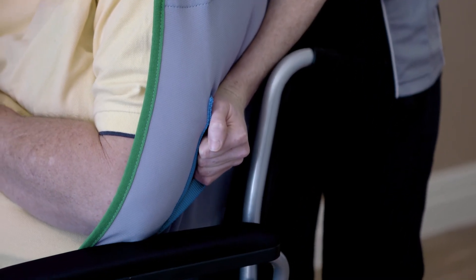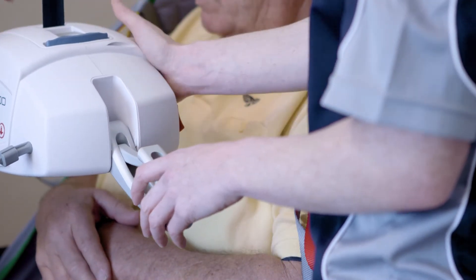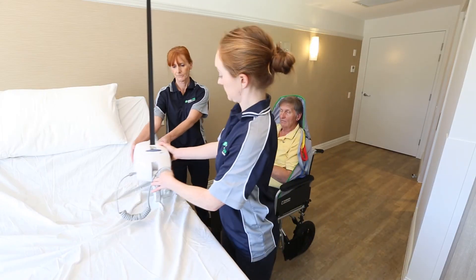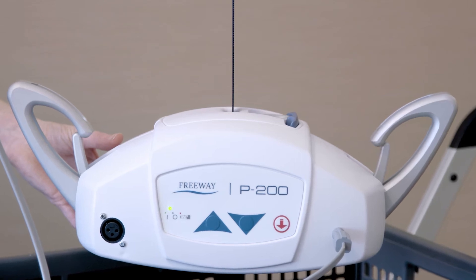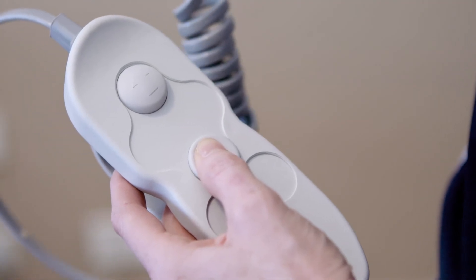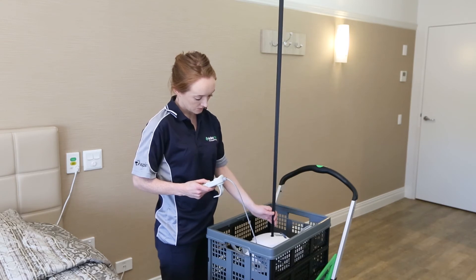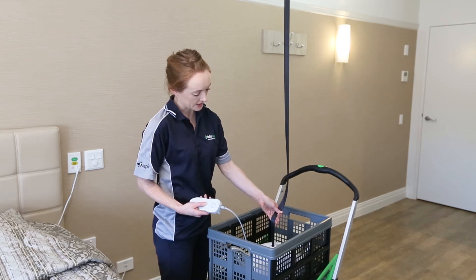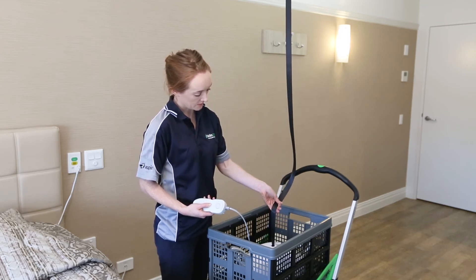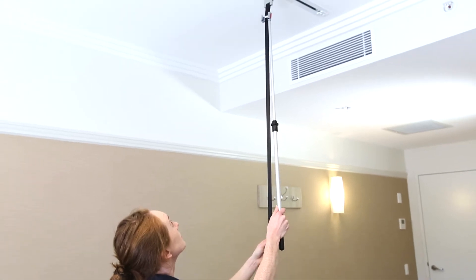Setting the chair a little back will help you to do this. When the resident is safely positioned and sling loops are slack, detach the sling from the hoist and move it out of the way, then remove the sling from under the resident. To take the P200 off the ceiling track, make sure the hoist is located over the transport cart and then press the DOWN button. When the hoist touches the transport cart, it will automatically stop lowering. This is because of the slack sensor, which is a safety feature of the P200. To overcome this, gently pull upwards on the lift tape while continuing to press the DOWN button. When there is enough slack in the lift tape, use the reacher bar to remove the P200 from the ceiling track.